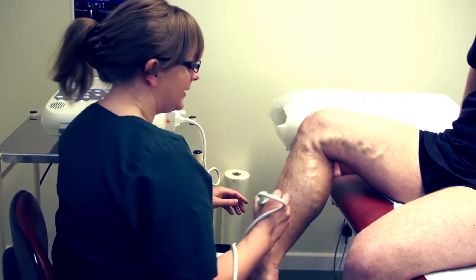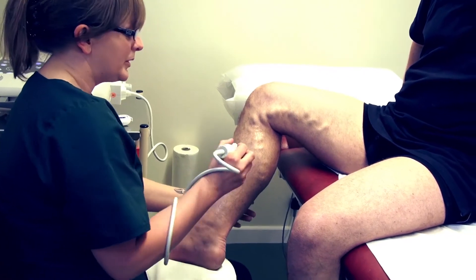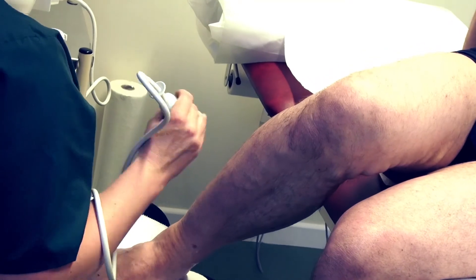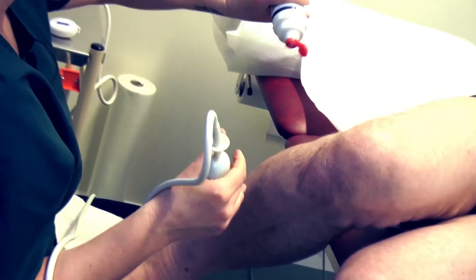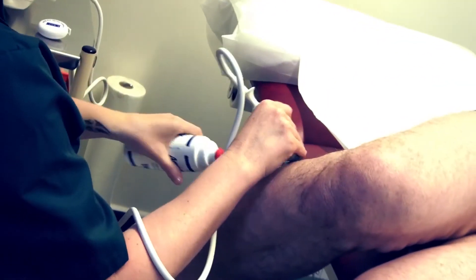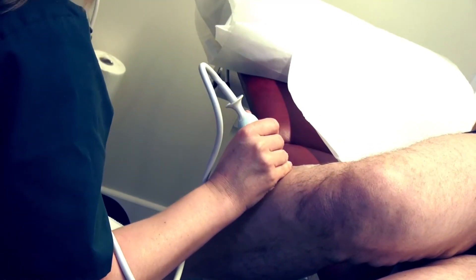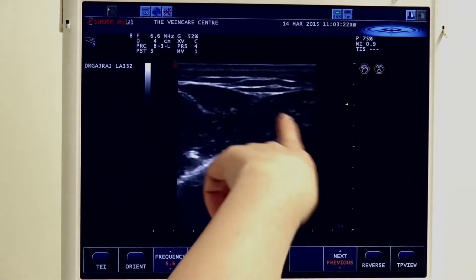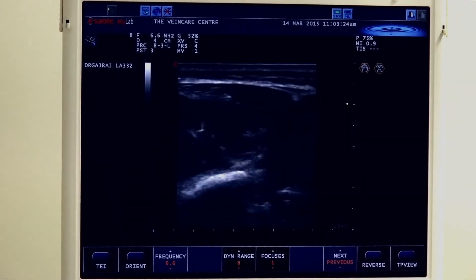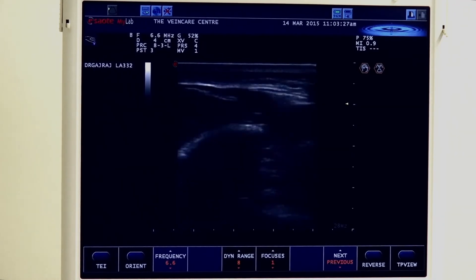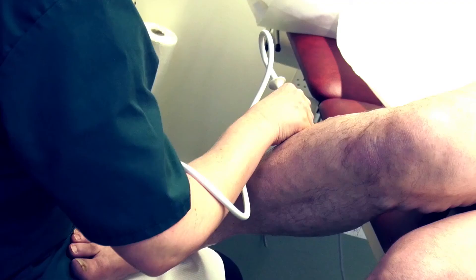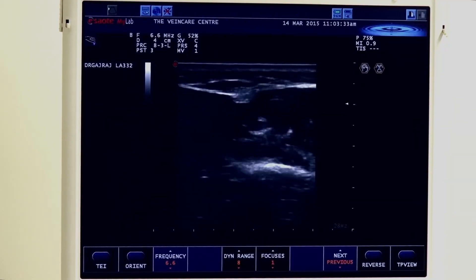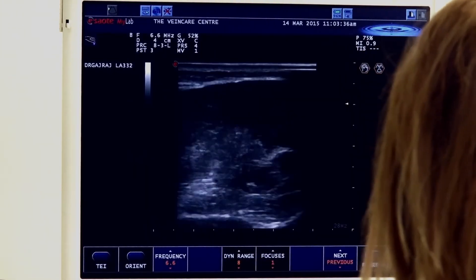We also check for any lateral calf perforators, looking for any perforation through the superficial fascial layer — most commonly at the area of the muscle joints, just sweeping up and down the calf. We can see we have no lateral calf perforators for David. And then we're going to check down the posterior calf.